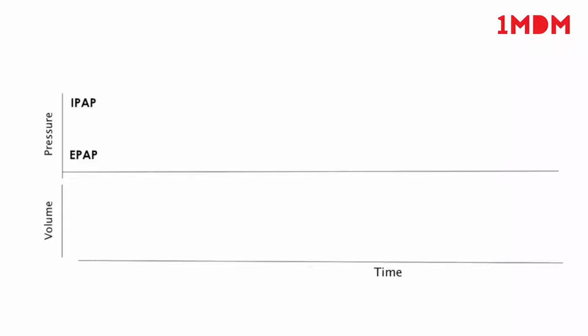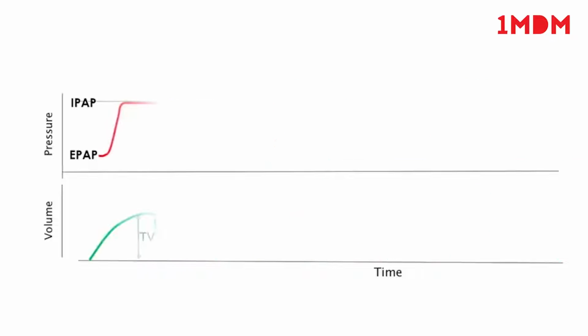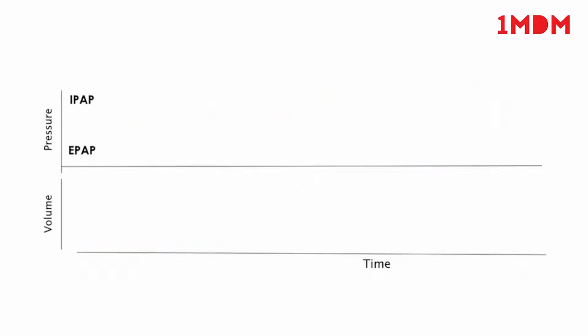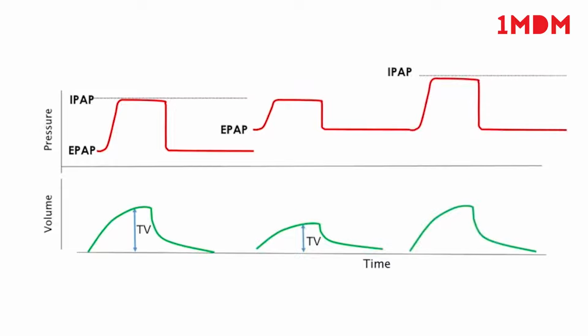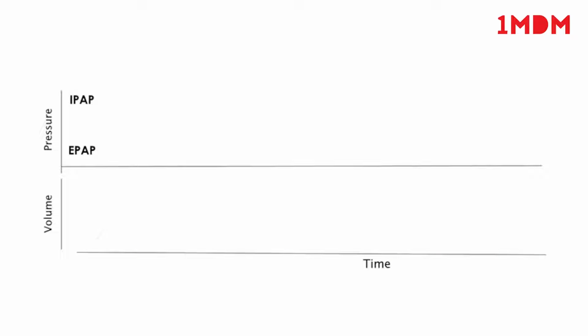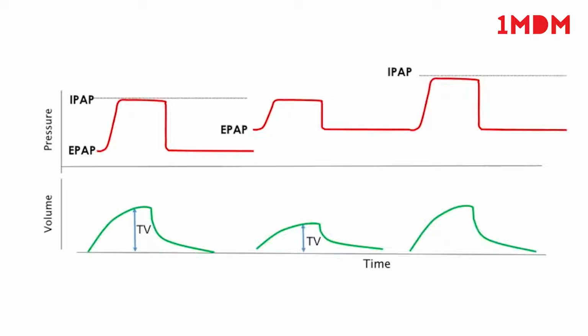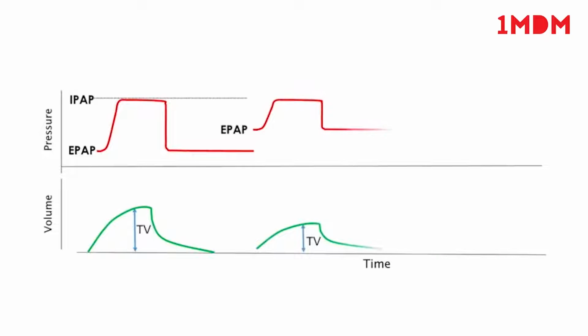When you repeat your gas, if your CO2 remains high, increase the tidal volume by increasing the IPAP. If the patient remains hypoxic on the gas, increase the EPAP or the FiO2. Remember, you may need to increase the IPAP to maintain tidal volumes. Ensure the NIV prescription is updated and repeat the ABG 1 hour after any settings change.